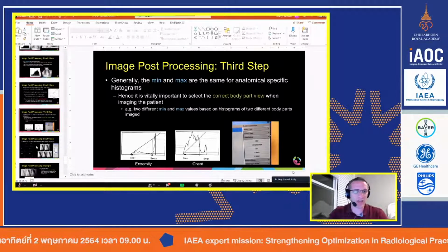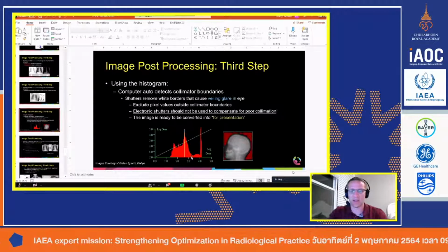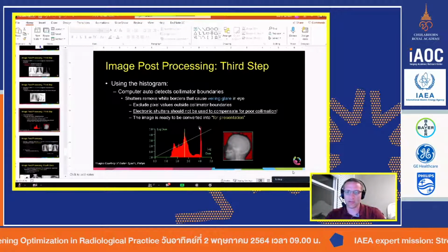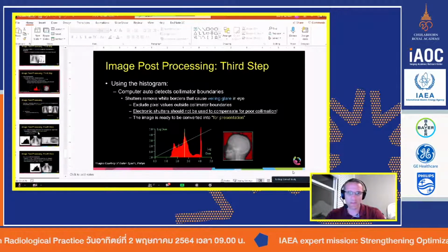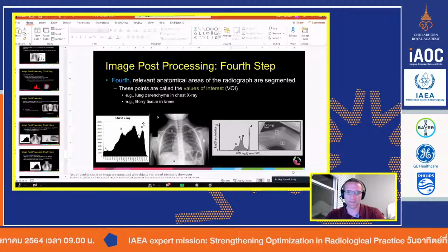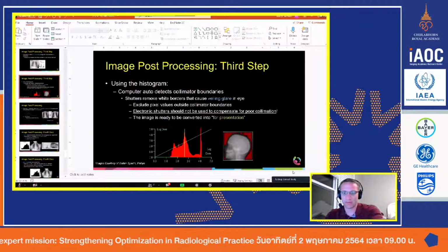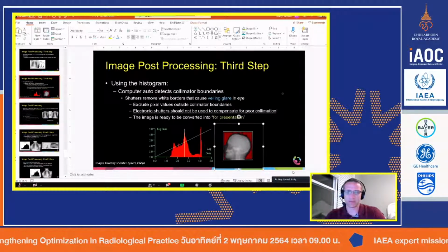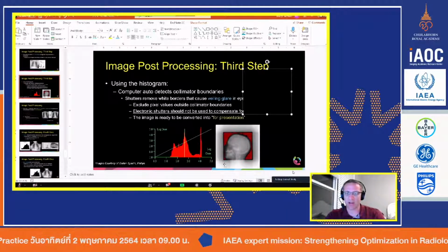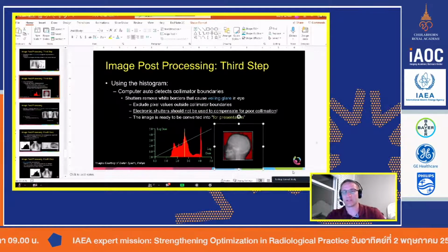The other question that you had was, how would the histogram change if you're not collimating properly? If you have a lot of air, so actually let me go back. Air, you see D right here, that's over on this side of this histogram. If you did not collimate, in this case, where'd it go? Oh, I know why. There you go. I hit it. If you did not collimate, you're going to have a lot of air out here. Actually this white is the collimator blades. In reality, it would be black, right? It would actually look like this because it's all air.